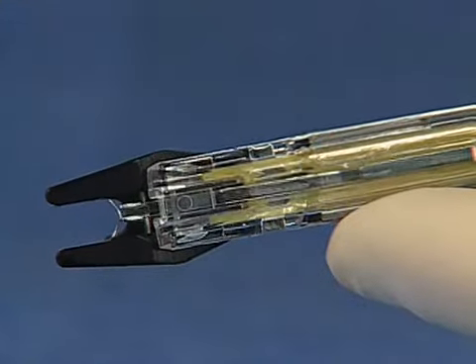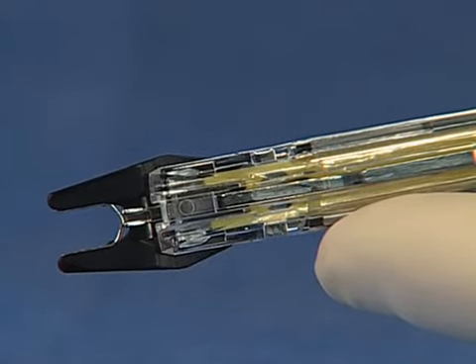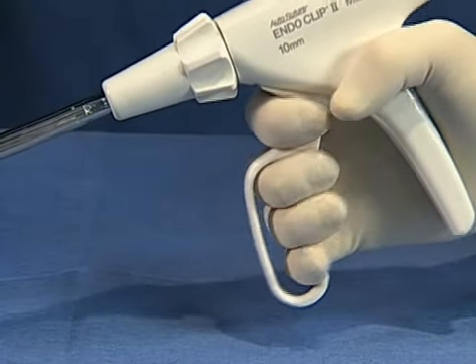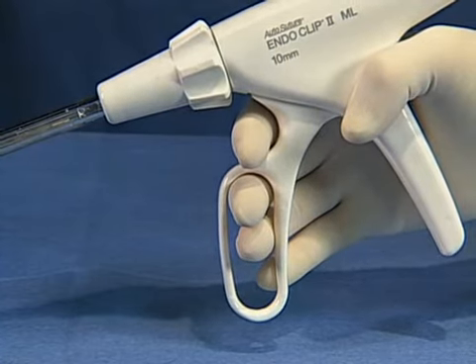When there are no clips left in the applier, a yellow indicator will appear in the clip window, indicating that the applier is empty. A safety interlock feature prevents the handle from being squeezed, ensuring that the empty jaw will not close on and potentially damage tissue.